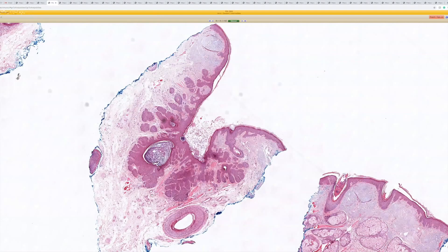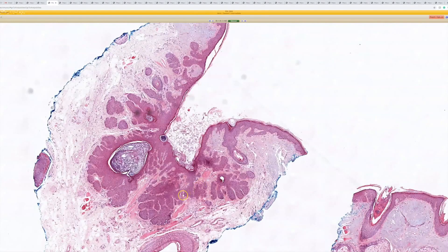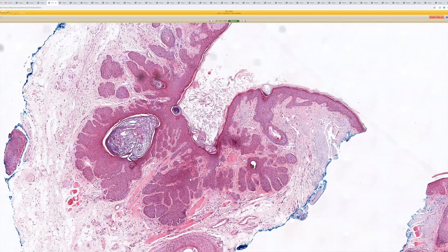That's a perfect description, and exactly what the differential is. You've got the invagination that's dilated, very similar to dilated pore of Winer, which is basically the punctum of an epidermoid cyst or a follicular infundibular cyst — dilated pore of Winer and those look essentially identical, and they probably represent just two ends of the same thing. But when you get these enlarged finger-like processes, the rete ridges that are puffed up and expanded out from what looks like a dilated pore, you can use the name pilar sheath acanthoma.